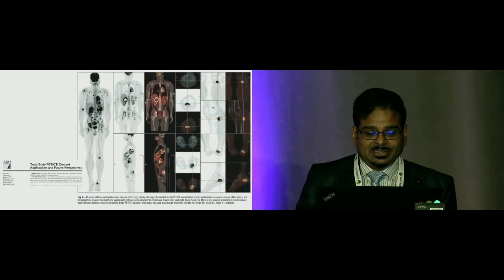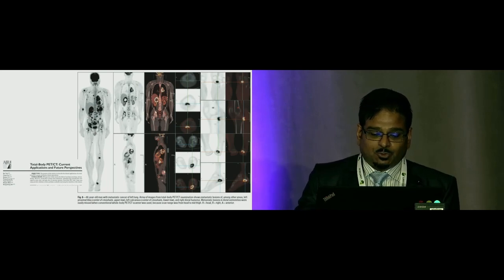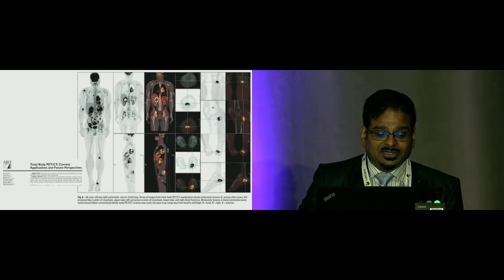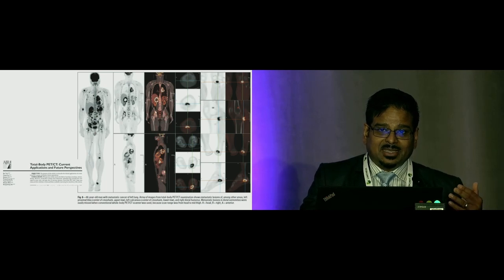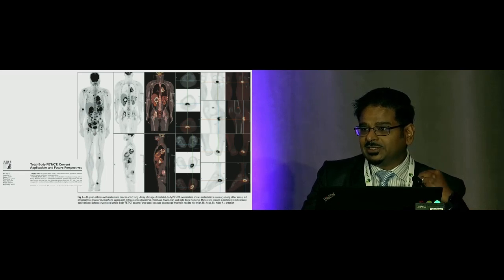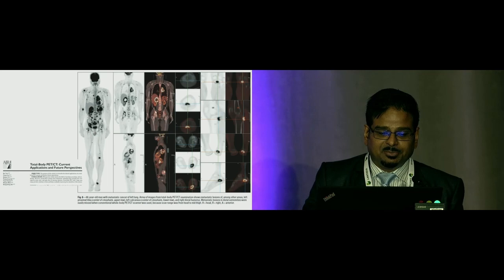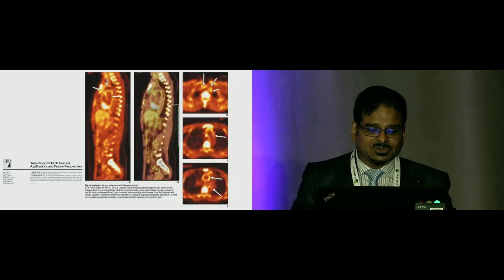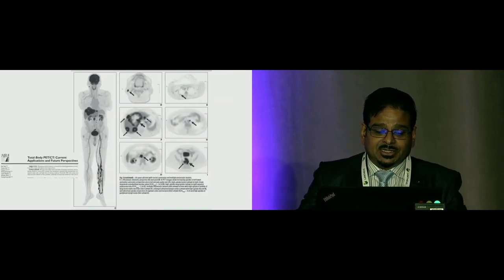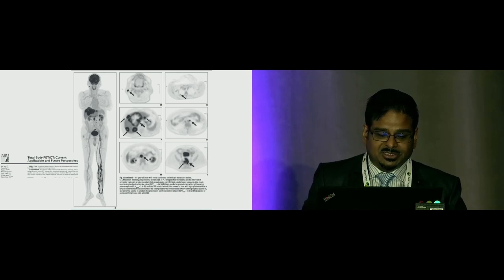I'm not going to go into detail on these applications where the experts have already spoken about, but this really again shows you the value of the total body PET CT, in which you have the entire body encompassed, and having a tracer like F18 FDG or the novel tracers, you're able to actually examine the entire body, and that's really impactful. So Takayasu's arteritis, Dr. Shi already spoke about. Then this is another interesting case in which a patient presenting with colon cancer and liver metastasis, but you can see varicosities in the left-sided dorsalis pedis, which can be picked up.